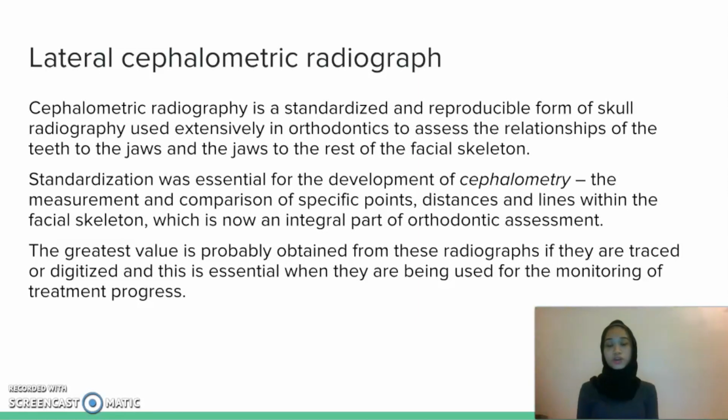The measurement and comparison of specific points, distances, and lines within the facial skeleton is now an integral part of orthodontic assessment. The greatest value is probably obtained from these radiographs if they are traced or digitized, and this is essential when they are being used for the monitoring of treatment progress.